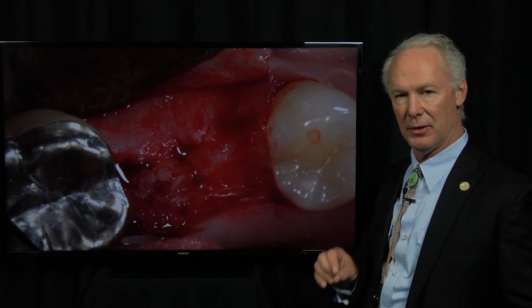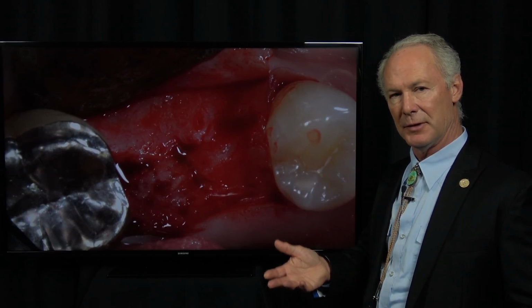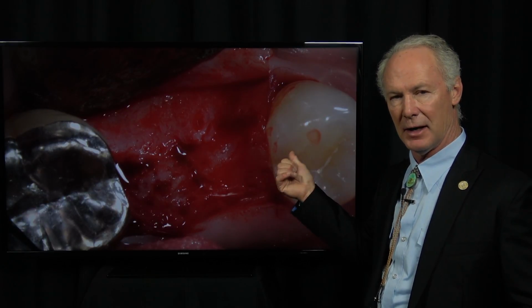And you must bone graft it with either bone graft material or platelet-rich fibrin, which I like better, and not look like a swayback horse. You want a flat alveolar crest, and look what we got.